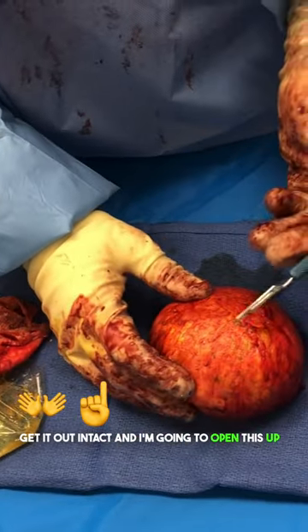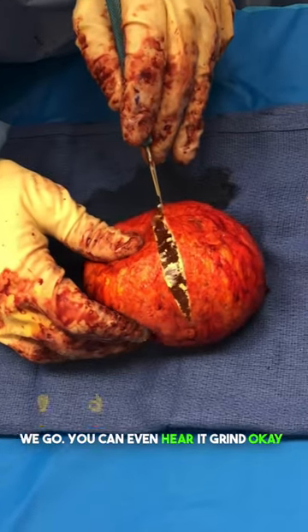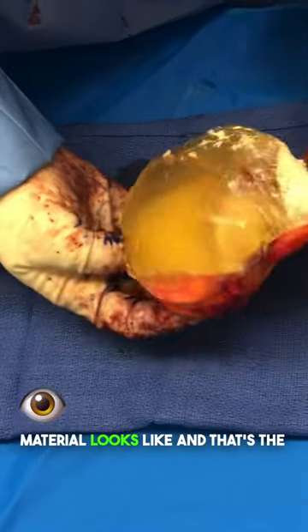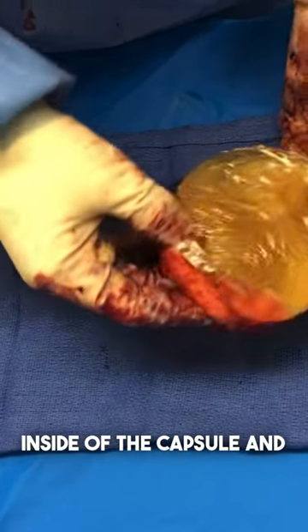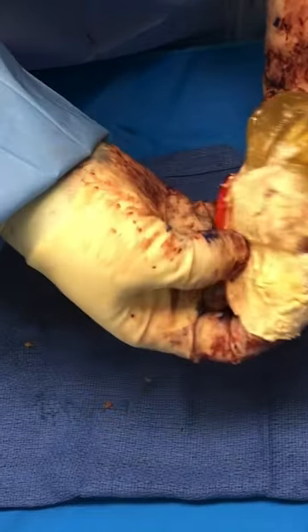I'm going to open this up now to show you what it looks like. It's very gritty — you can see the knife is struggling to get through, and you can even hear it grind. This is what ruptured silicone material looks like on the inside of the capsule. These are silicone implants from the mid-1980s.